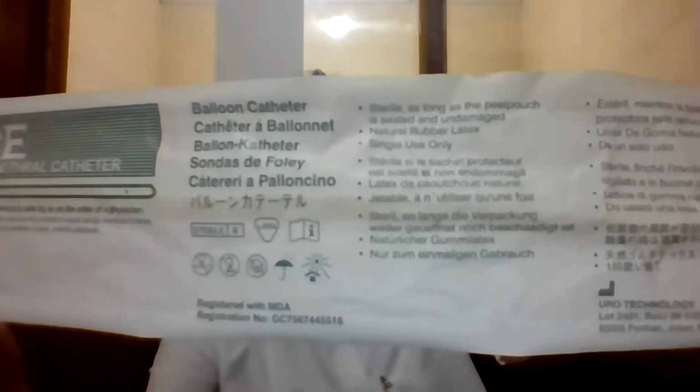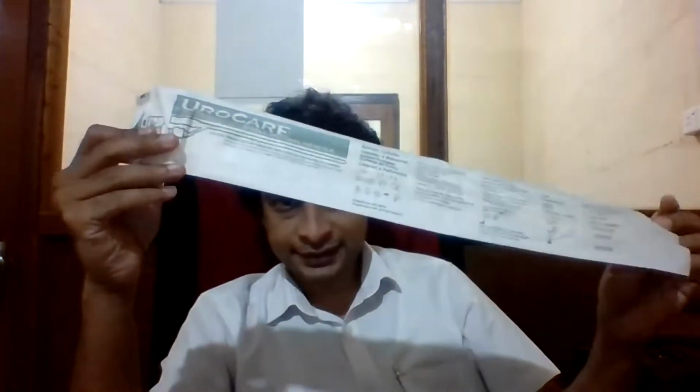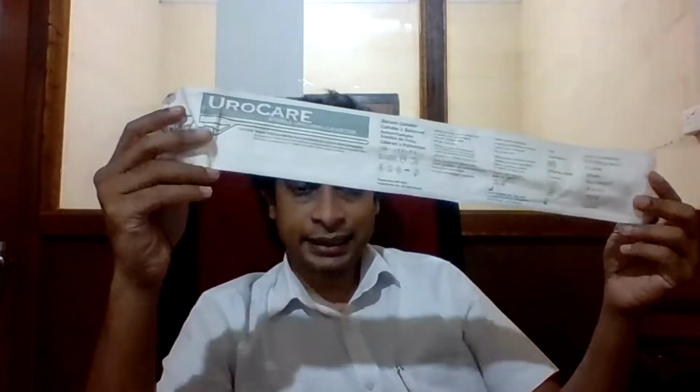Catheters made of rubber latex cause a lot of irritation if they are left for a long time. The longest that a latex rubber catheter can stay in the urethra is about 3 to 4 weeks. If you want it to continue, then you have to change the catheter, right? If not, you have to put a different kind of catheter that stays for longer. Those are called silicone catheters, right? So silicone catheters can stay for up to 3 months. Okay, they don't cause as much irritation, but they're more expensive, right?